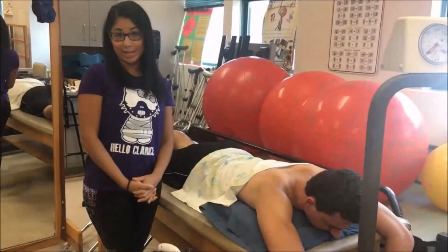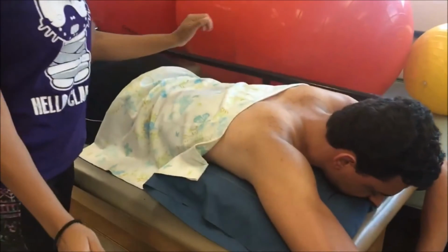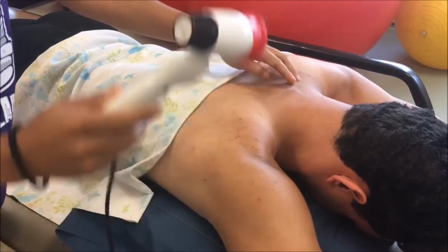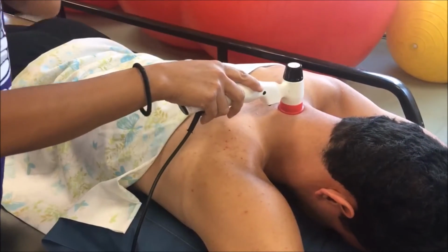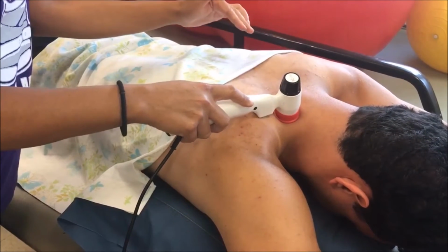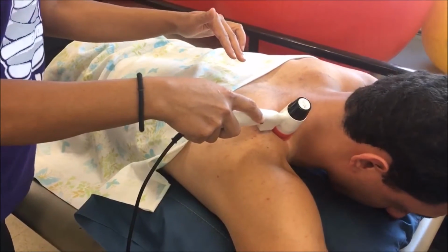Hi, my name is Ingrid, and I'm going to be demonstrating placement of the laser. First, we're going to start with the cervical area. If the patient has a herniated disc on the cervical spine, for example on C5, we'll place the laser on the vertebrae where the herniated disc is, and then we would follow the path of the radicular pain, and move the laser along that area where the pain is radiating.